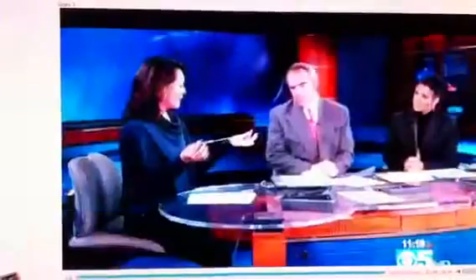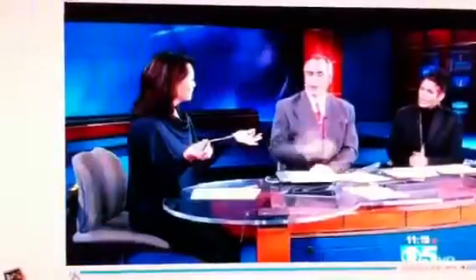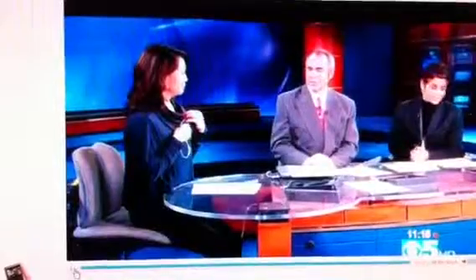This is what's inside. We don't have the actual device itself, but it's pretty long. It's wrapped in plastic, and it has a tiny tube inside, which is how it measures the electrical activity. So, pretty amazing stuff. And that goes right into the heart muscle, and if you're having problems, it can jumpstart. That's right. One end goes into the heart, and the other end goes into the device, and it stays inside the whole time. Wow. Amazing technology. I know. All right, Grace, thank you.